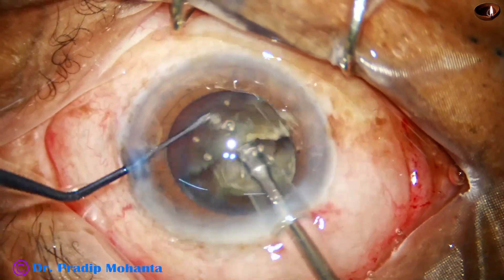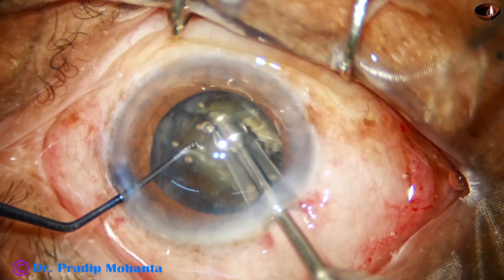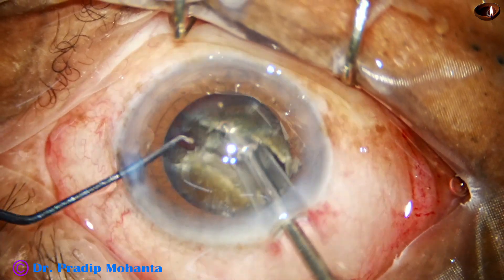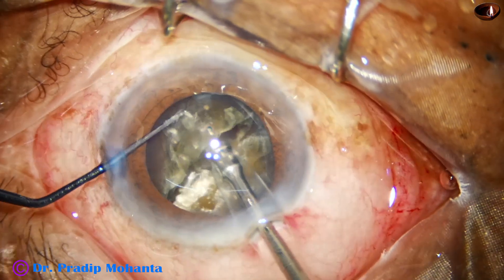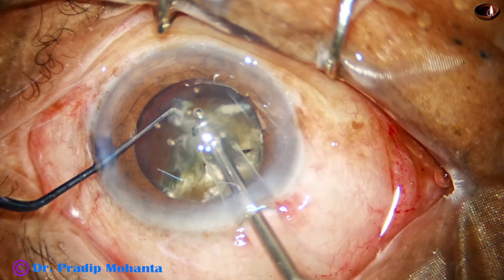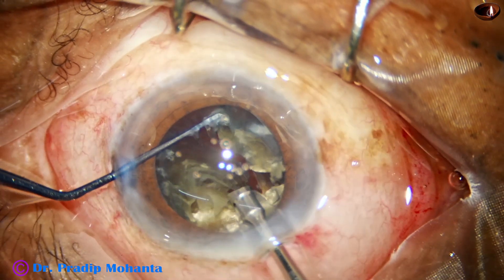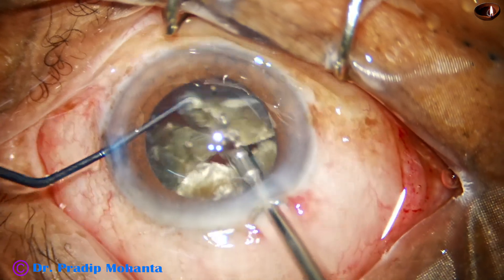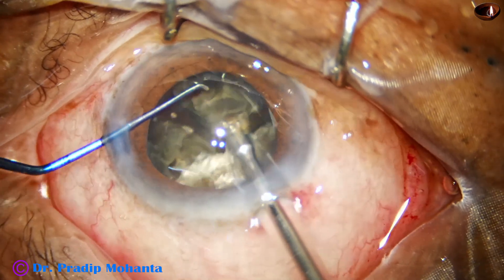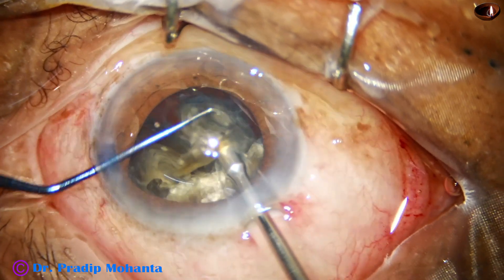Now I come to the other side, rotate the nucleus 180 degrees, come to the other side and hold on the hemi-nucleus and separate the two hemi-nuclei completely. Then one hemi-nucleus is being subdivided into two pieces. You must have noticed that the handpiece — the phaco needle — is taking the main role in dividing the nucleus, not the chopper.